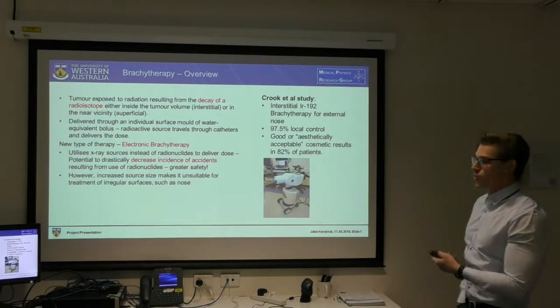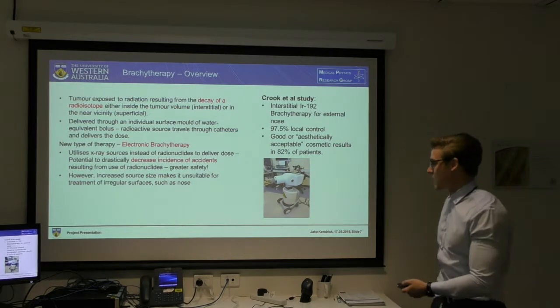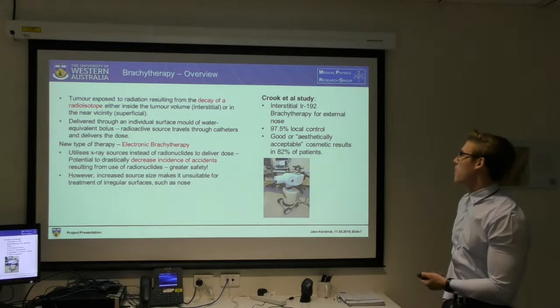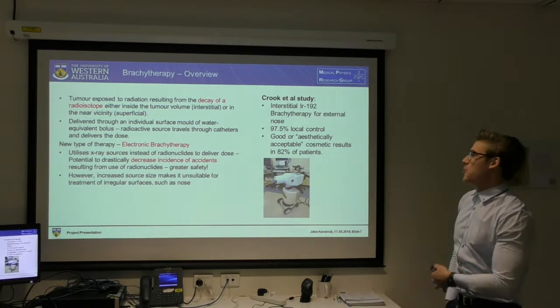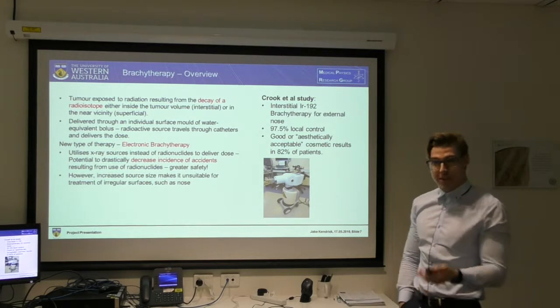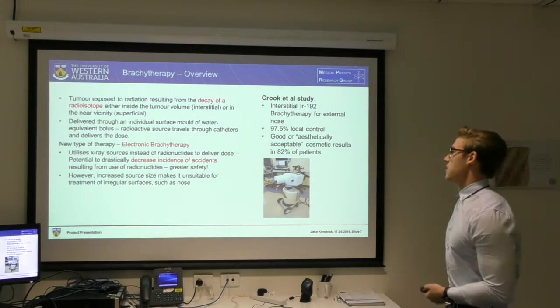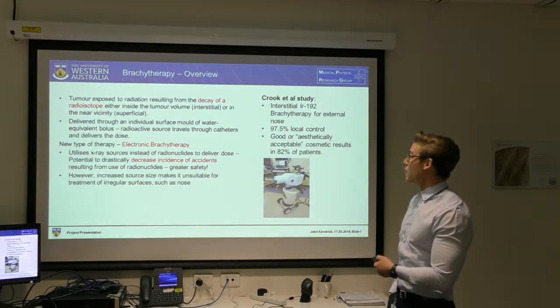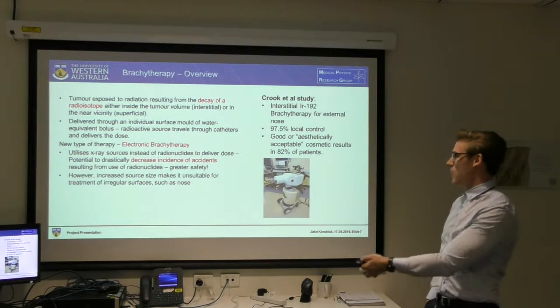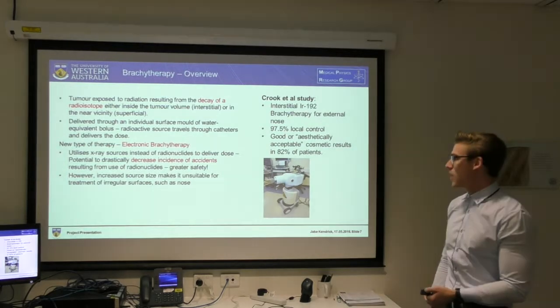So this leads us to the radiotherapy side of things. The first one that I'll be analysing is brachytherapy, and just a brief overview of this. It's basically when the tumour is exposed to radiation resulting from the decay of a radioisotope, either inside the tumour volume or in its near vicinity. It's usually delivered through an individual surface mould of water equivalent bolus, and the radioactive source travels through catheters and delivers the dose that way.